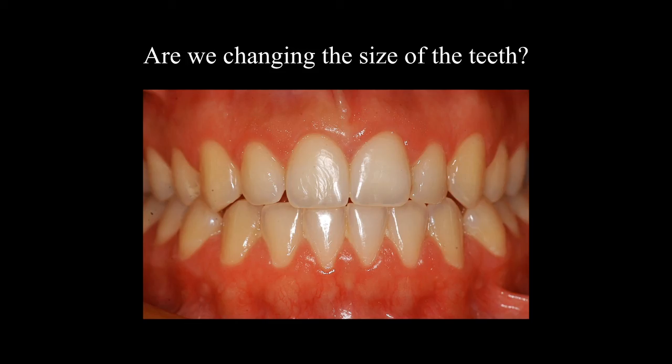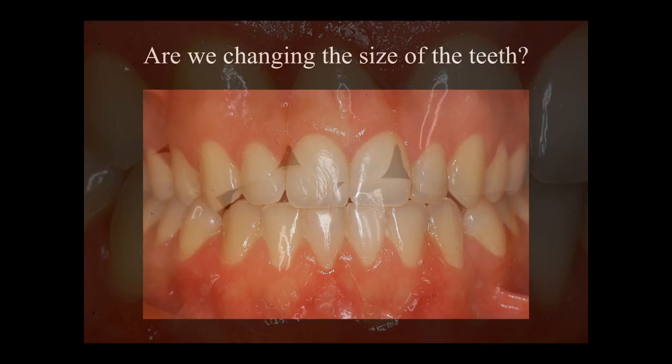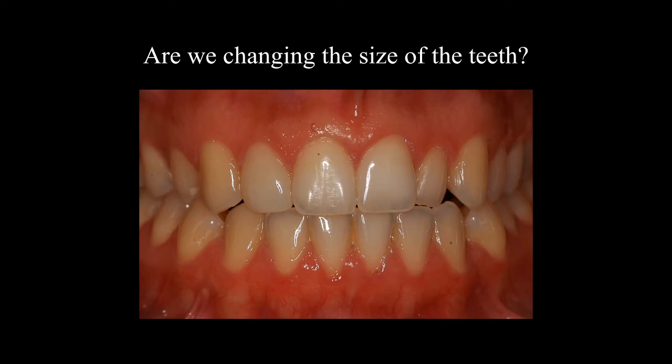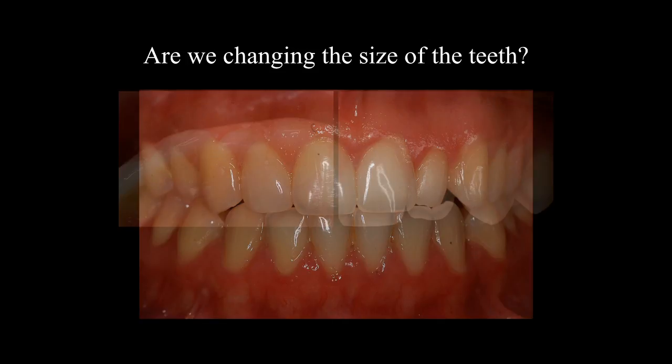As you can see, this is the bite that she has. We need to secure a better overlap so as not to have a lateral sliding into a class 3. For that, we look closely at the tooth. It's a tooth that has full enamel. It has a nice translucency. We can just do a prepless veneer for this case and put the tooth into a proper position with a slight overlap to secure the occlusion.